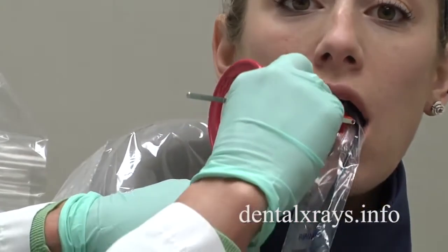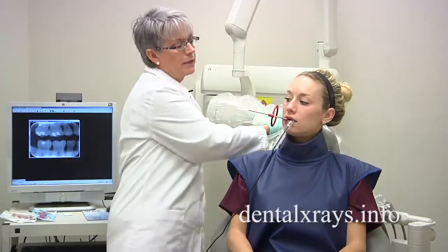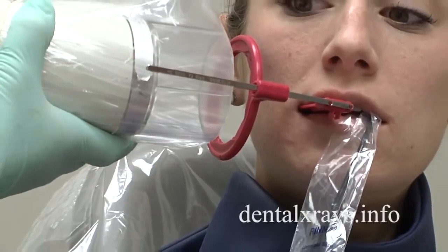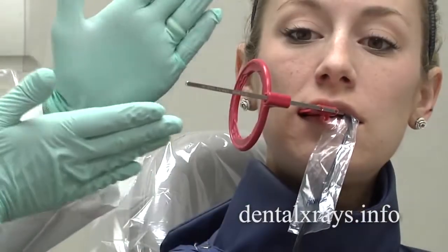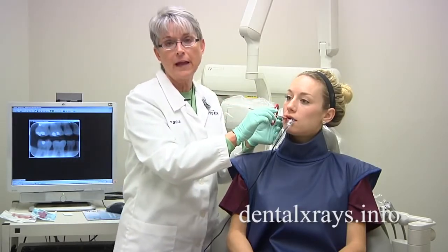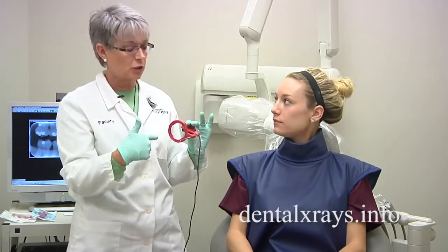I'm twisting it in the mouth and having her bite down. However, you cannot take the x-ray just like this because if I take this while it's twisted in the mouth, it's a paralleling technique and the horizontal angle is going to cause overlap. So what I like to call is thinking outside the circle.